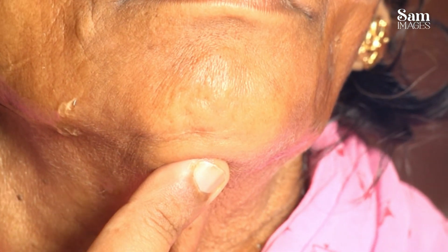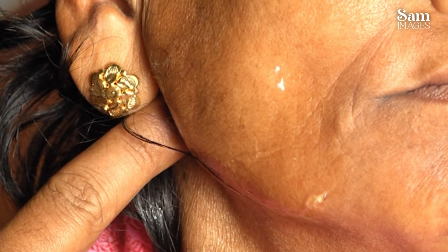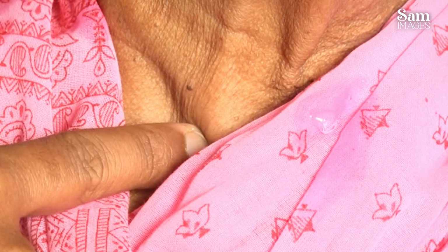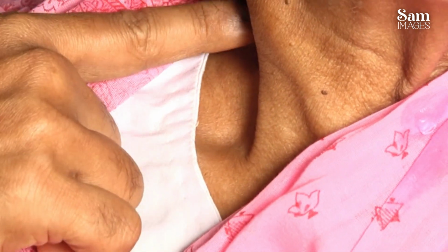This is the submental and this is the submandibular, upper deep cervical. This is upper deep cervical and mid cervical area. This is mid cervical, this is the sternocleidomastoid muscle, and this is the mid cervical area and lower cervical area. This is the lower cervical area, and then when I come here, this is the supraclavicular and posterior triangle.